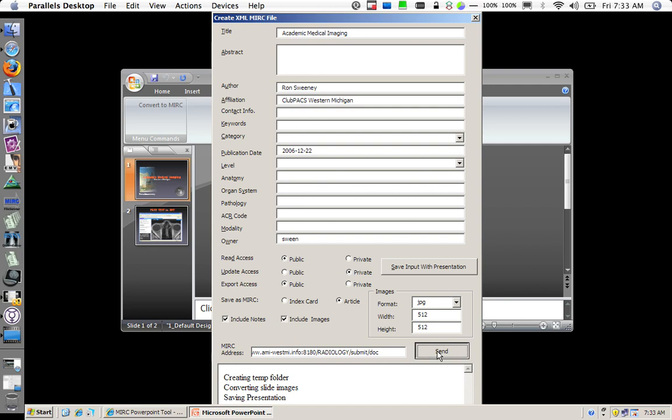Now what it is doing here is three things. It is taking each one of the slides, converting them to a JPEG, and including those in the teaching file. Second, and probably most important, is taking all of the text from those and sliding them into a particular field so that they are now indexable and searchable on the MIRC site.